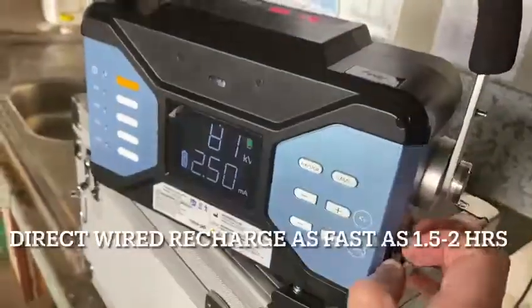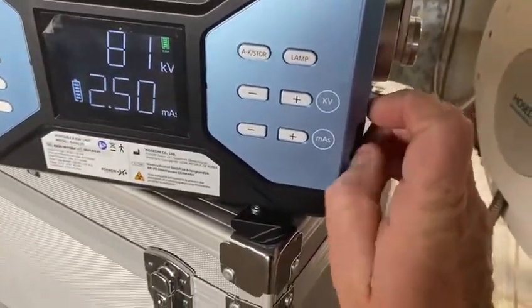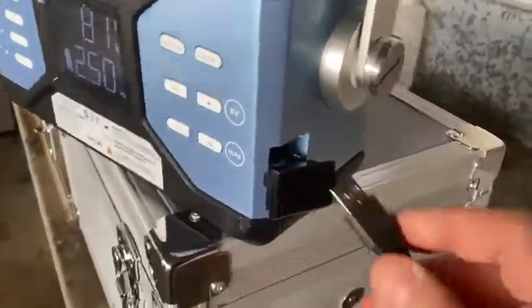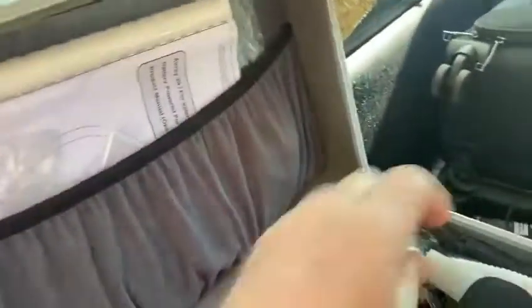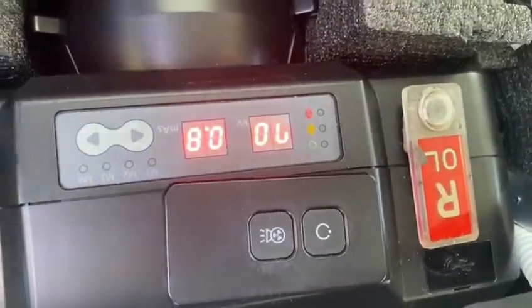You can also charge it directly into the machine by plugging in. One of the great features of this POSCOM x-ray machine is that it will charge while you're driving because it's plugged into the cigarette lighter. You just place it in here like that and it will sit in there and charge.